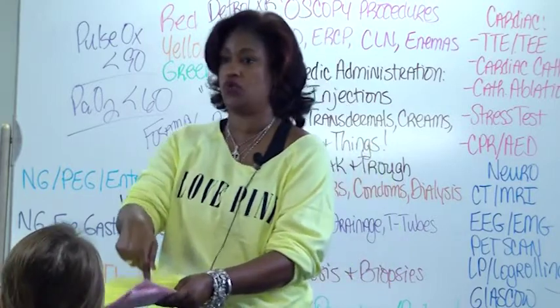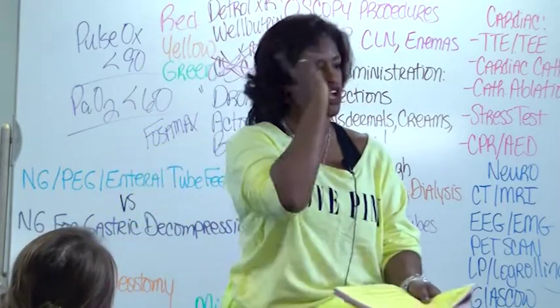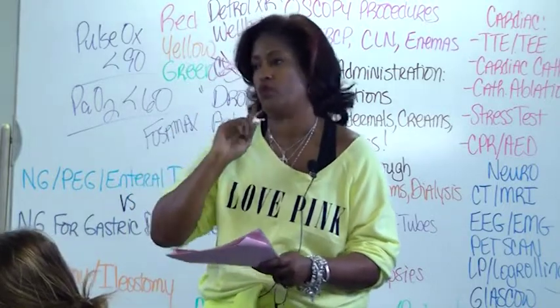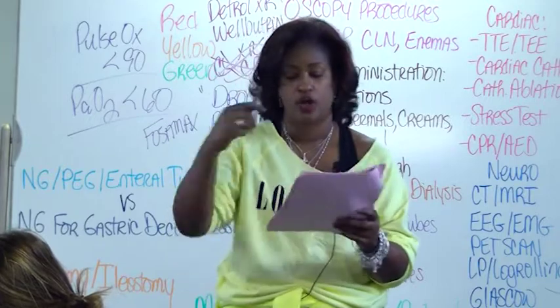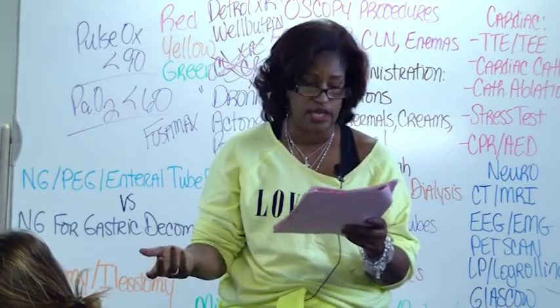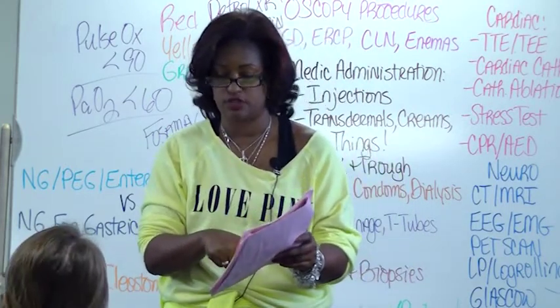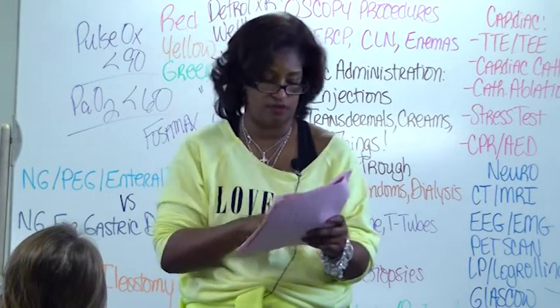But if I only have a couple patients with an NG and they only have a few meds, I'm going to do it the right way. I'm always going to do things the right way. Whenever it makes sense, I'm doing it the right way, okay? The reason you're doing this is because a tube can become occluded so easily. And by the way, I don't do 15. I do 30. I need to keep it liquid. I just do 30. Keep it moving, okay?